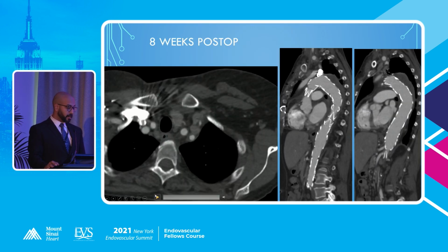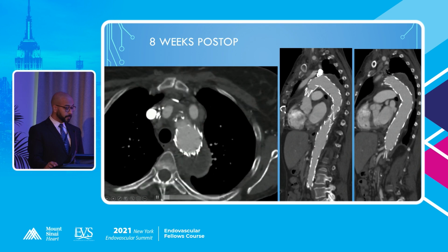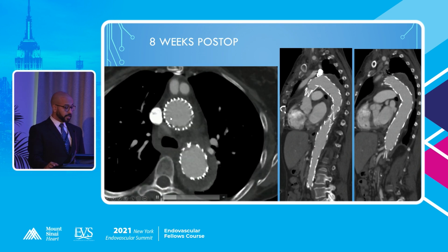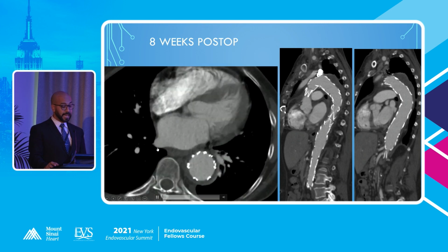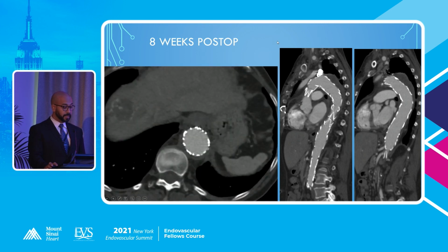And then this is her CT scan 8 weeks post-op, as well as 1 year post-op. It has remained identical to this, in which the true lumen has completely expanded. There's no further leaking into the aneurysm sac, and the false lumen has regressed, and we can see the positive remodeling here.